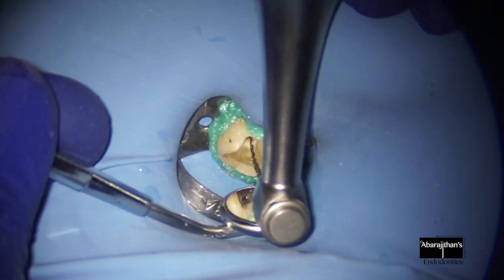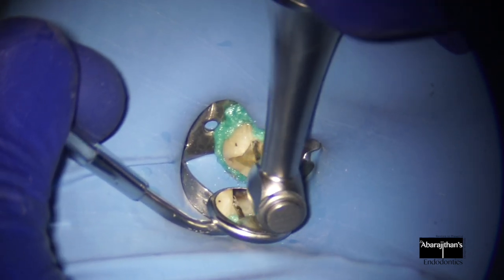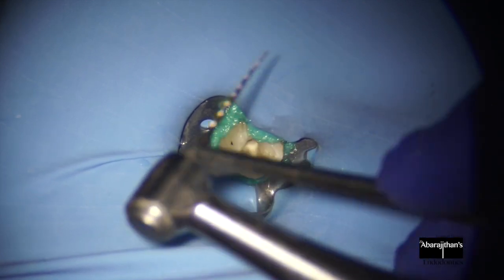When I clinically used it, this is a patient where I'm working on a lower second molar with limited mouth opening comparatively, and you can see the head of the handpiece is pretty nice and sleek.